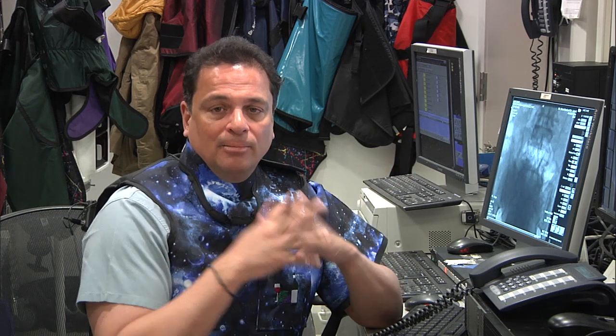So again, I apologize for the fact that we couldn't show you this live. However, I think for the sake of time and the sake of our crew, rather than watching us stick a leg and not being able to get in, we felt it would be more efficient to do it and explain the steps to you.